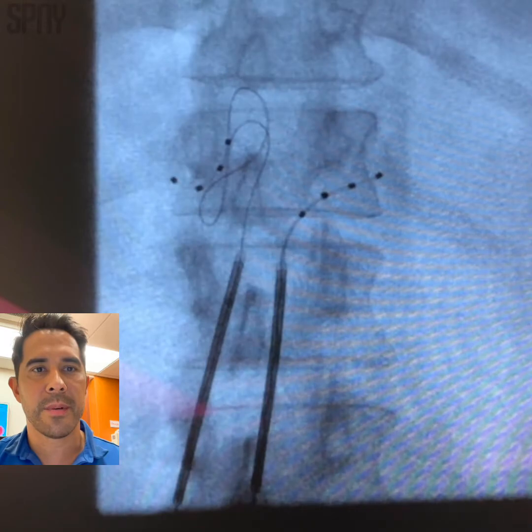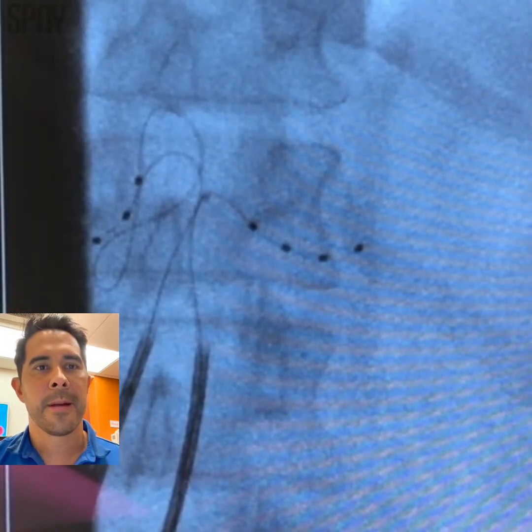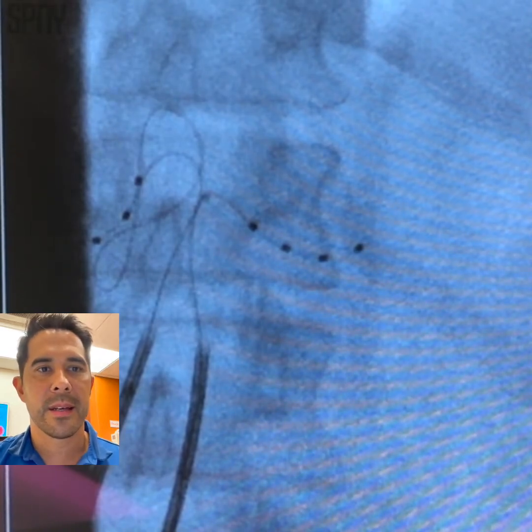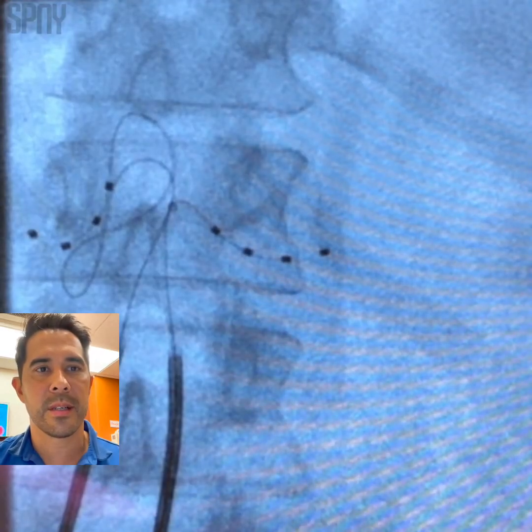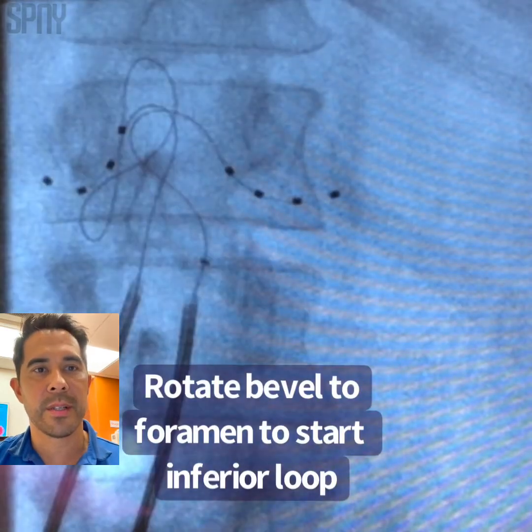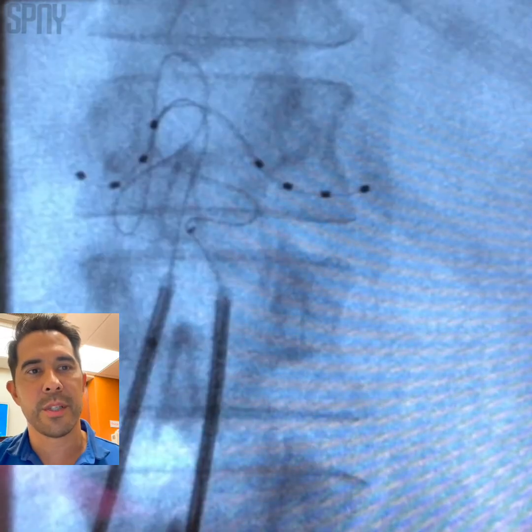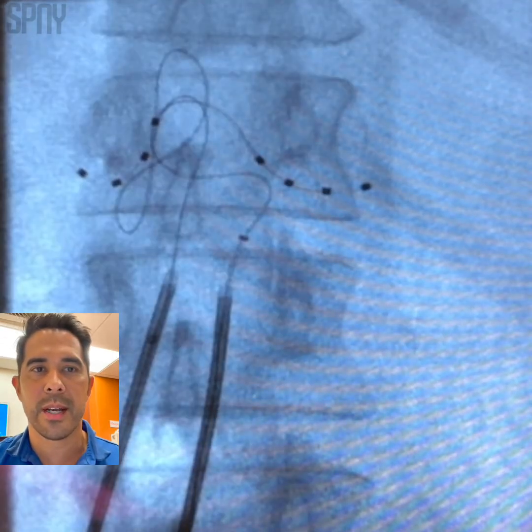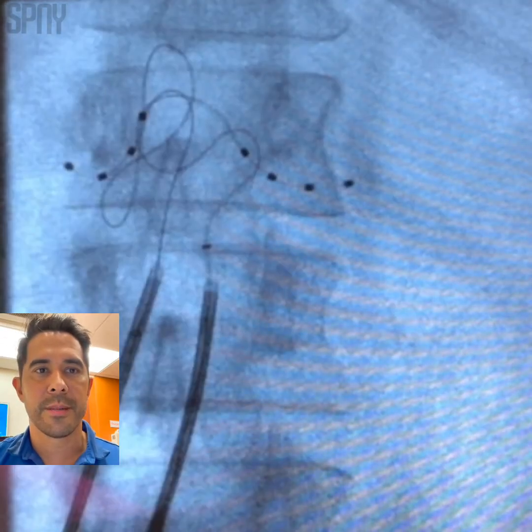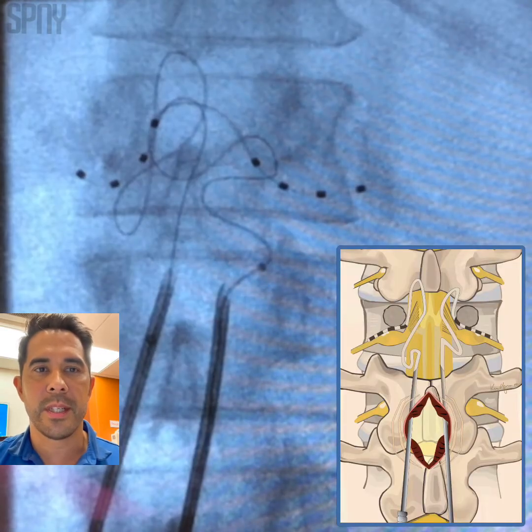I wasn't happy with it — there we go. Now we're advancing and doing the same thing, trying to pull it back in. We're going to take the sheath back. We turned it to the left, actually — made that loop. Now we're going to turn it to the right. Advancing, turn it back to the middle, push it up — and we're going to have our loops there. We've got double loops here, and this is being performed at the T12 level.